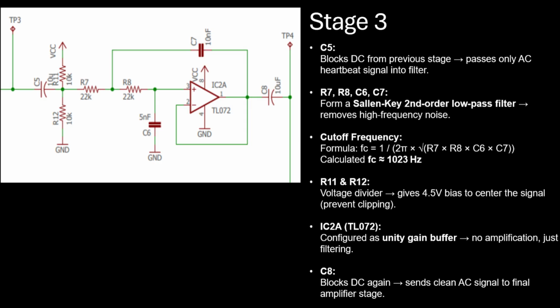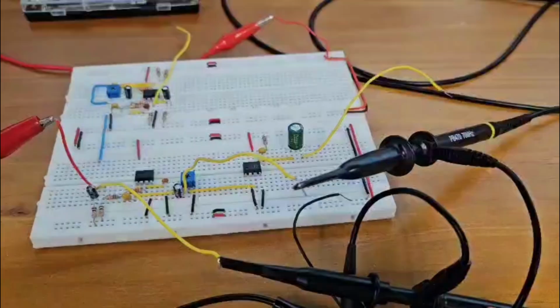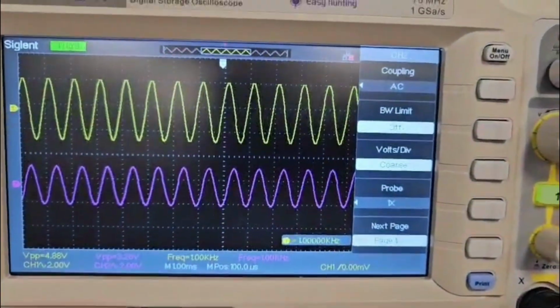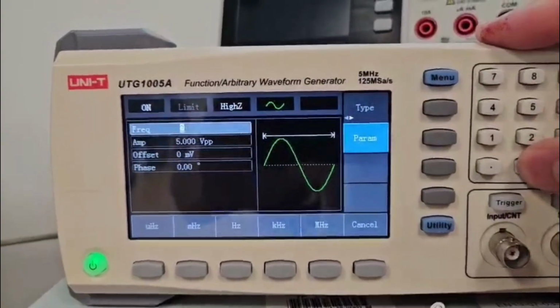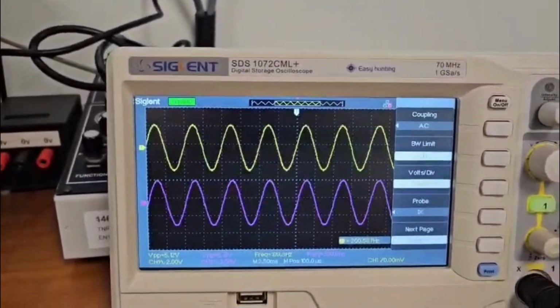stage 4. For stage 3, this time the function generator is placed right before TP3, and channel 1 is placed at TP3, and channel 2 is placed at TP4. So here it shows that it's at 1k Hz frequency and the voltage is 3.28 volts. And I'll be changing it to 200 Hz. Now we see that the voltage has changed to 5 volts.